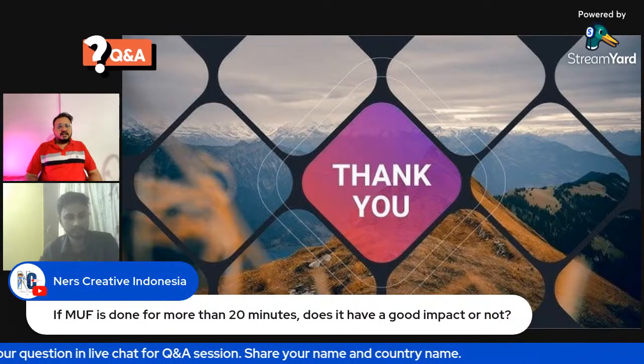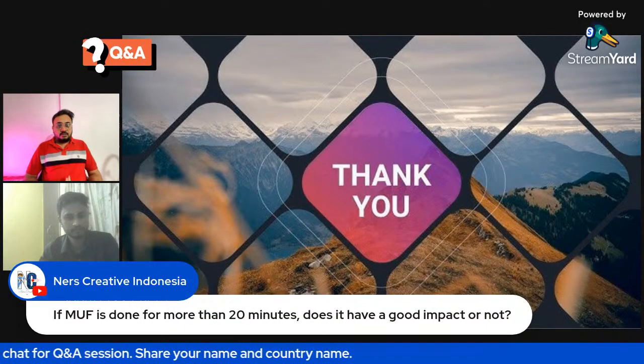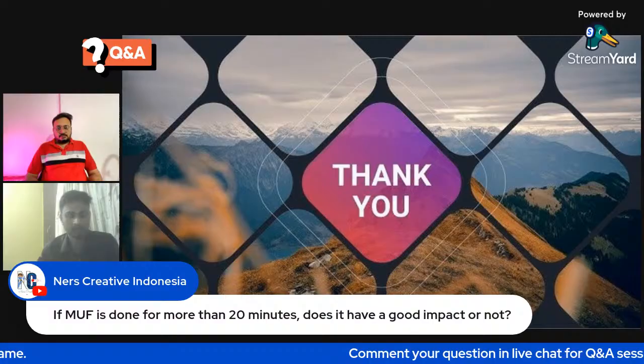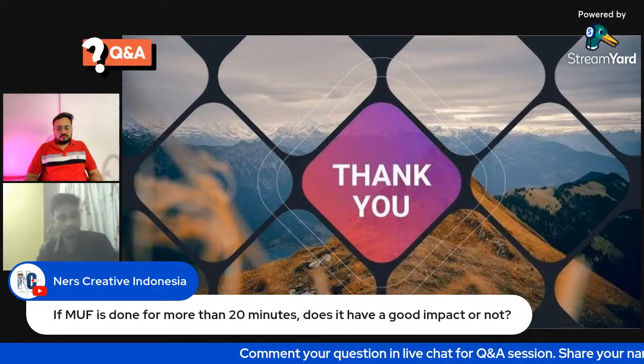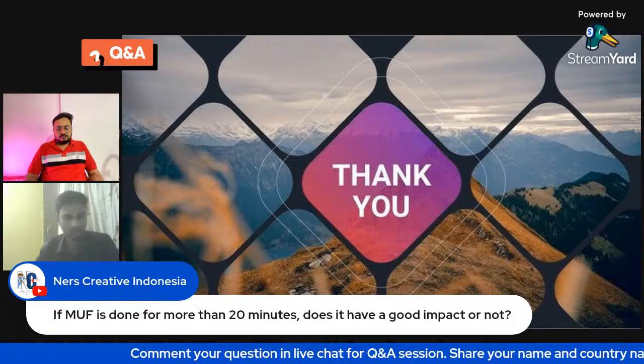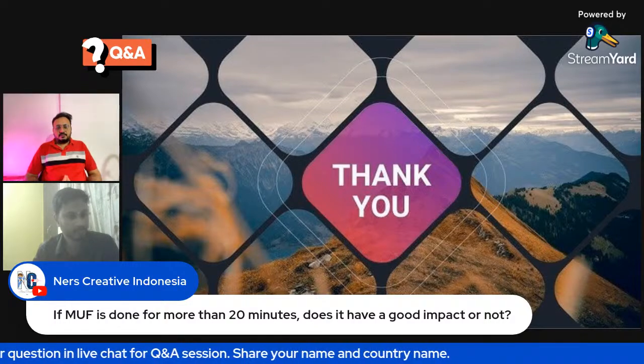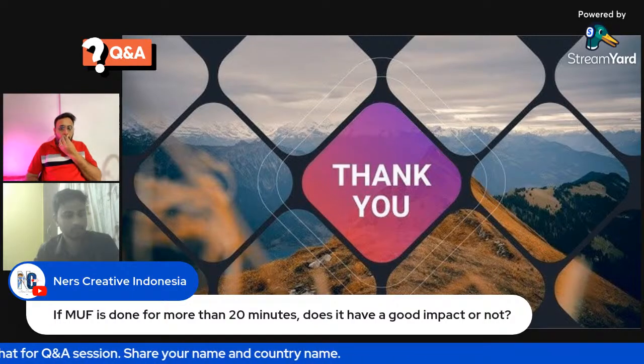So what are the indications for MUF and ZBUF? MUF will remove postoperative inflammatory mediators, that is the effect.